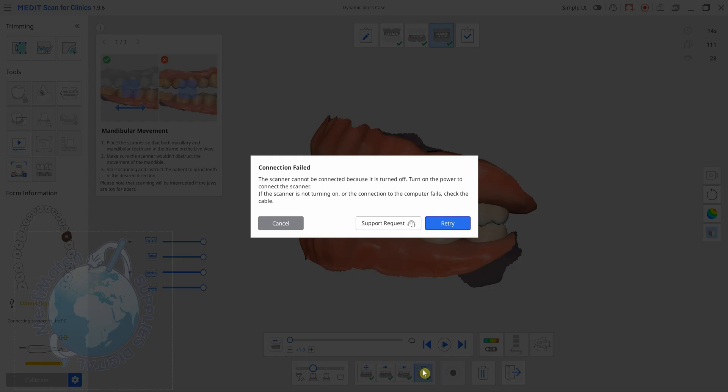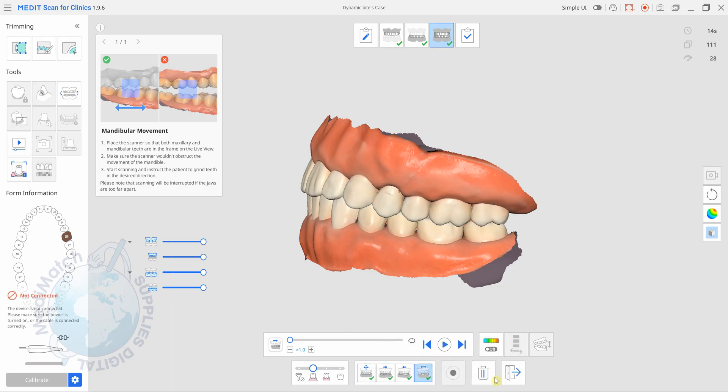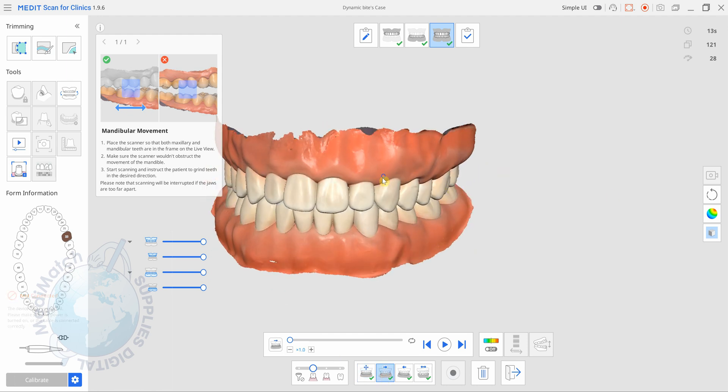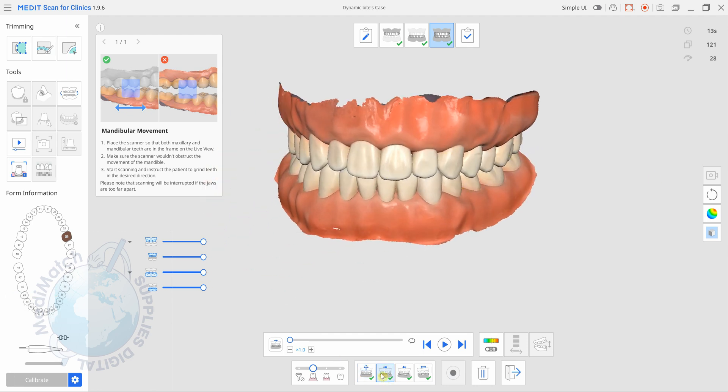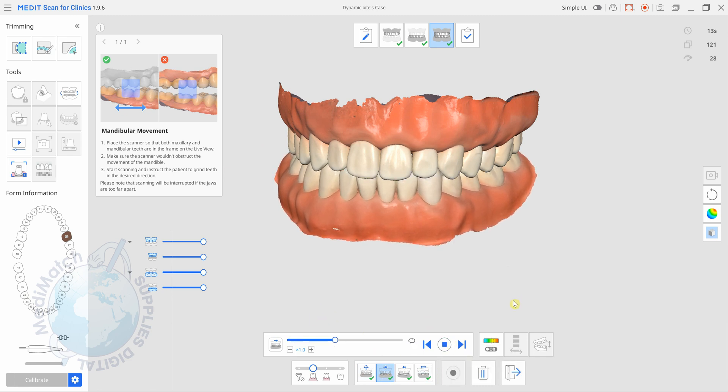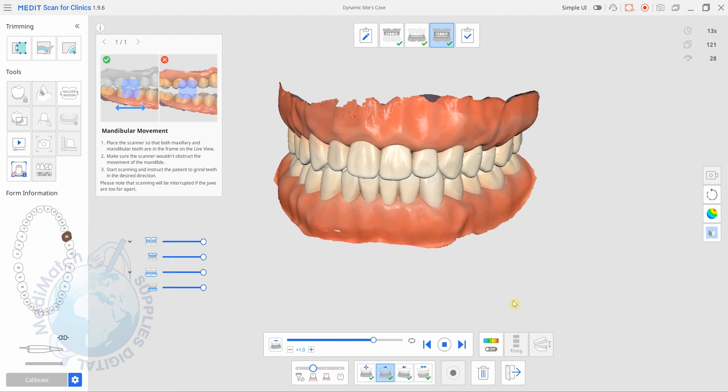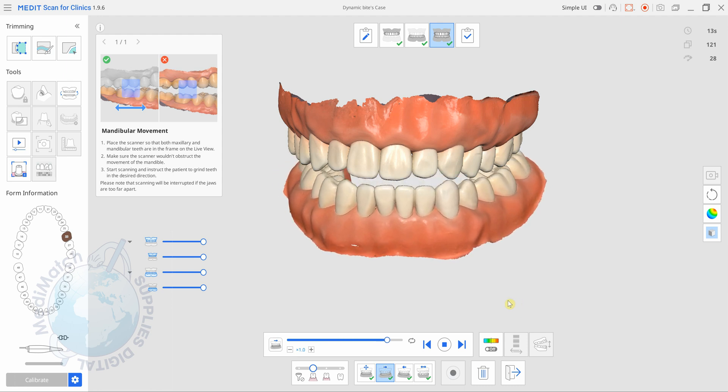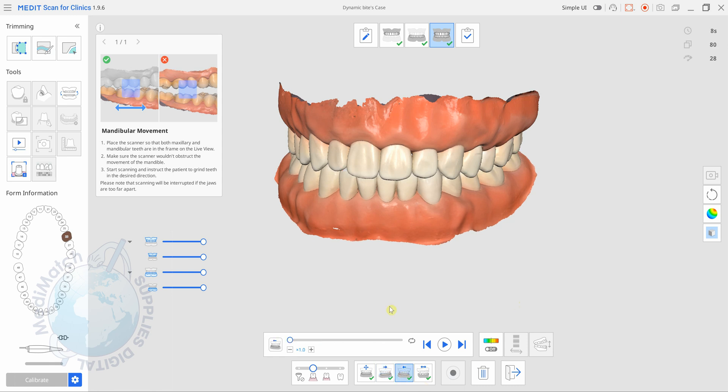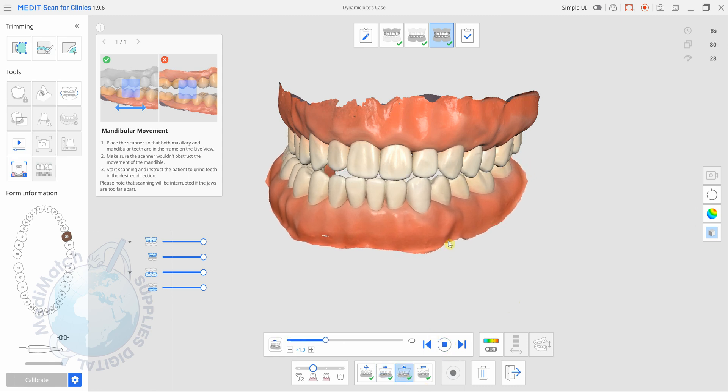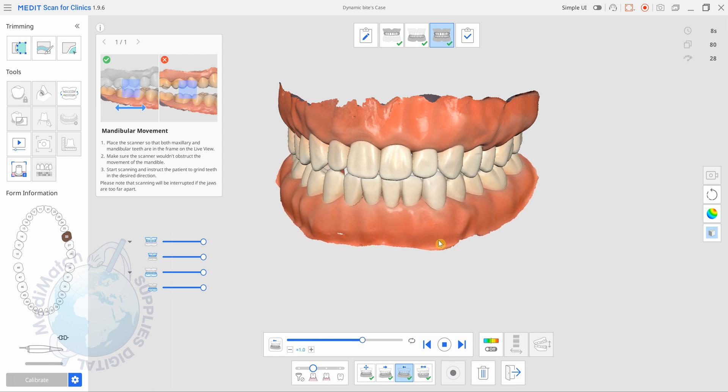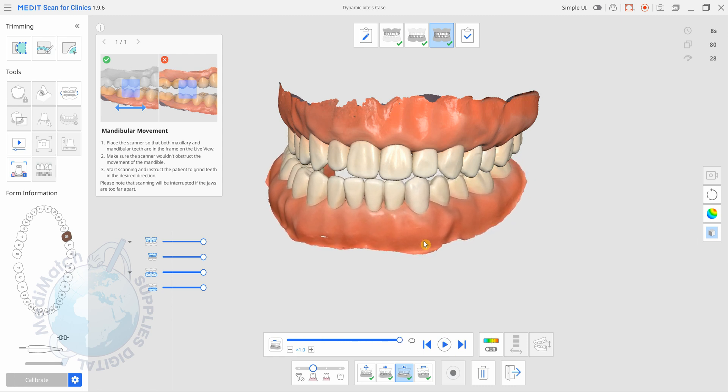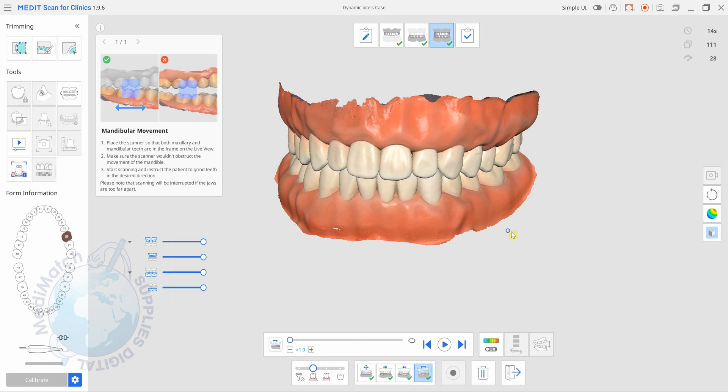Okay so at this stage I've just turned the scanner off. At this stage we can review any of these so if you want to look at the left and right. So this is the left you can press play. Same for the right and then the protrusion.